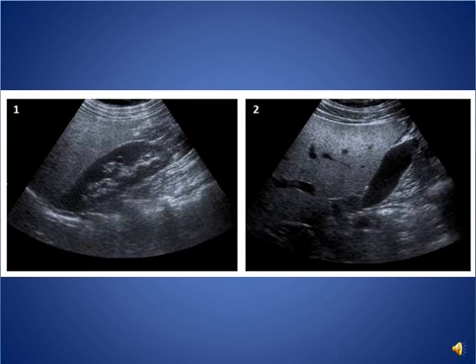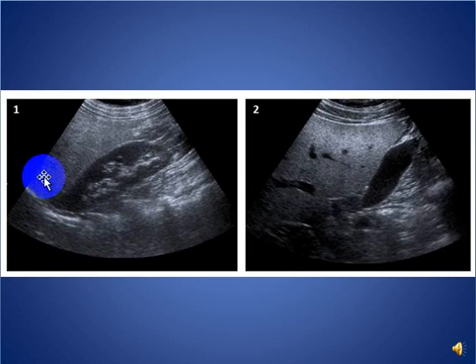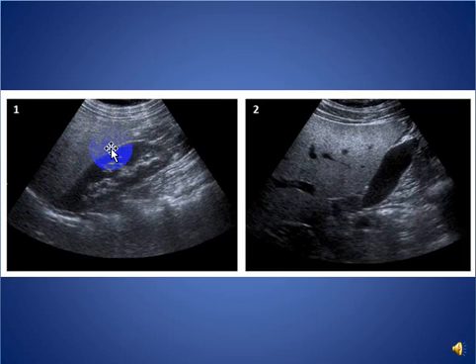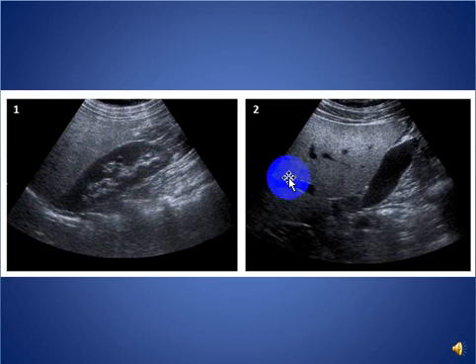My topic today is about presenting a case of ultrasound of the liver. As you can see here, there is diffuse increased echogenicity of the liver compared to the renal cortex, and it is almost equal to the renal sinus echogenicity.